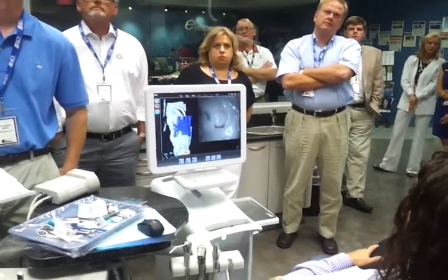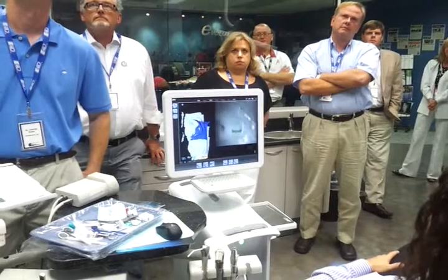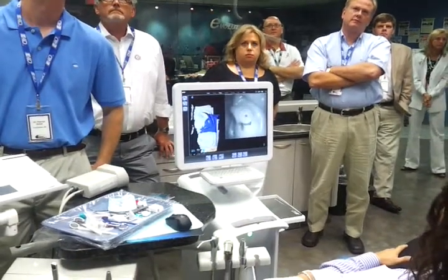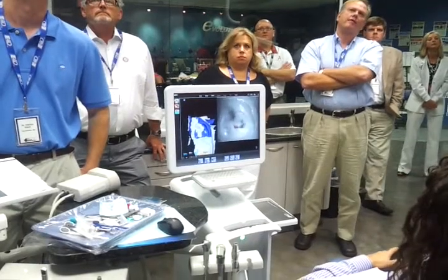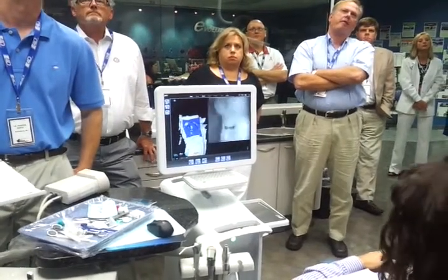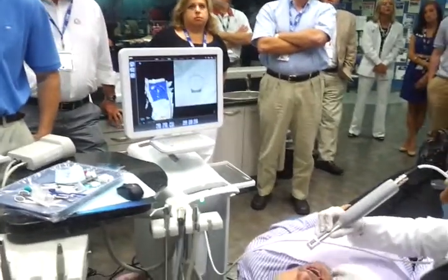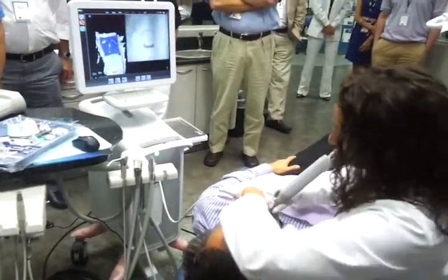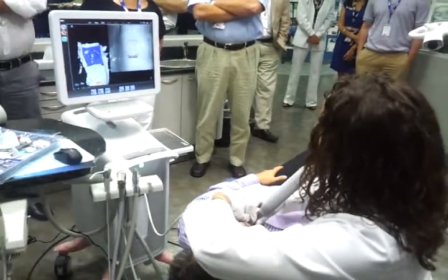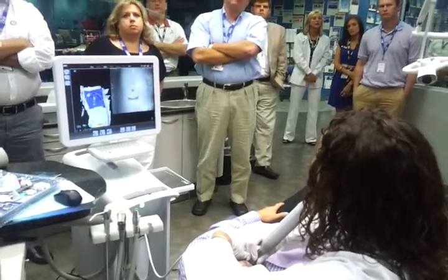And we're capturing full contour. The reason we capture full contour is because I don't want a generic tooth library. Now I really want to see what my true neighbors are like. I came up 2 teeth because with this system what I'm going to do is utilize my mesial neighbor to help me build the tooth anatomy.